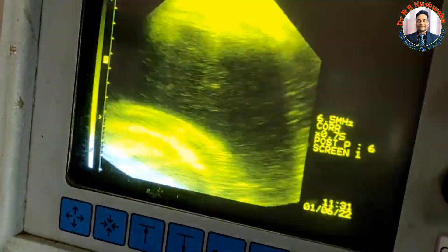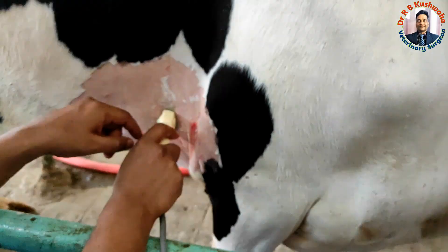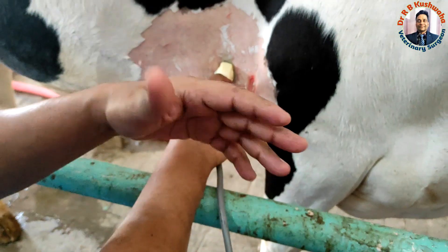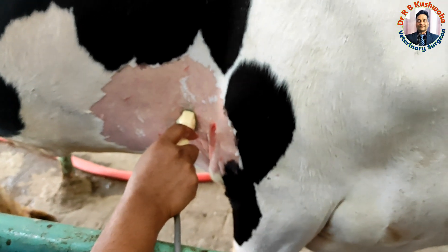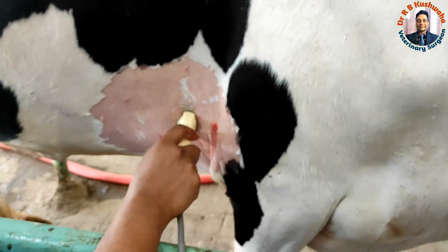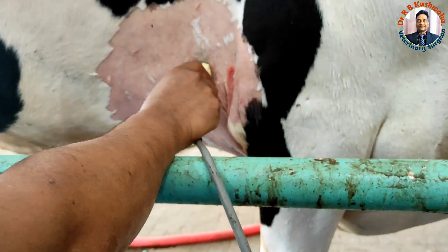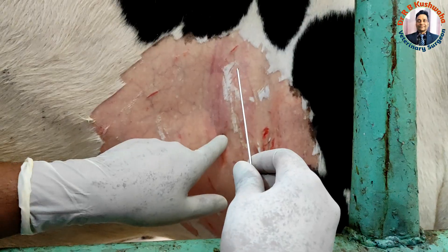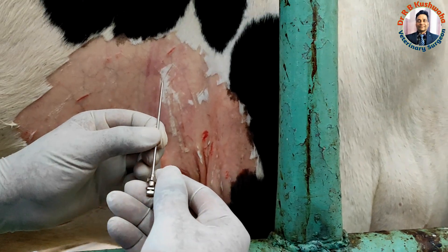Further, we diagnosed and performed needle aspiration. For the next procedure, we will perform needle aspiration at this area using lignocaine solution. At the same time, we also give standing sedation by a mixture of xylazine, butorphanol, and ketamine in the ratio of 1:2:3. We give 1.5 ml of that mixture volume-wise. We have injected 5 ml of 2% lignocaine solution here, and now you could see this is the spinal needle.